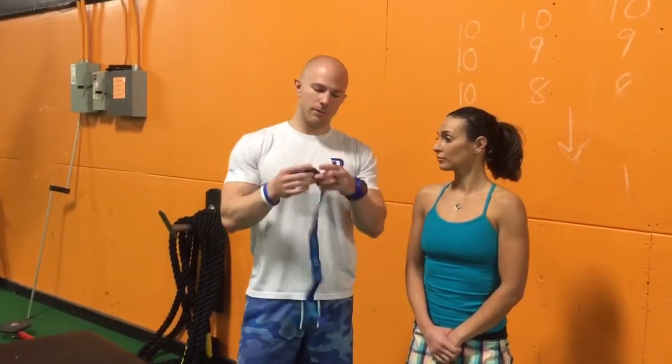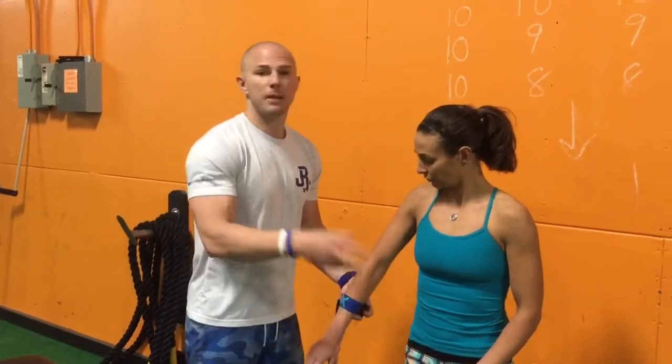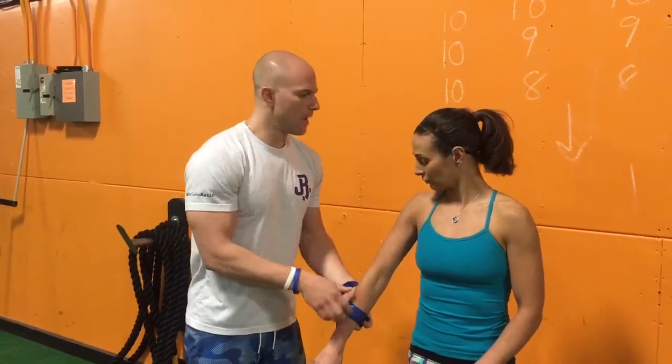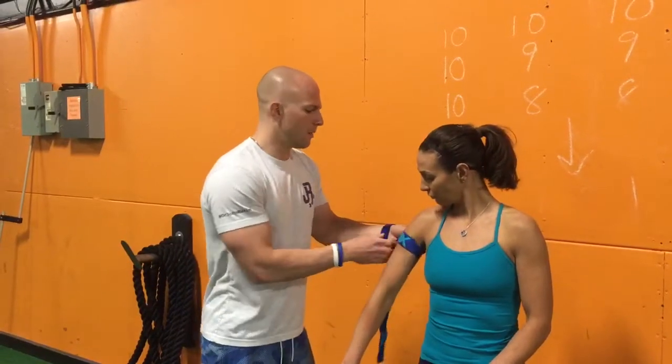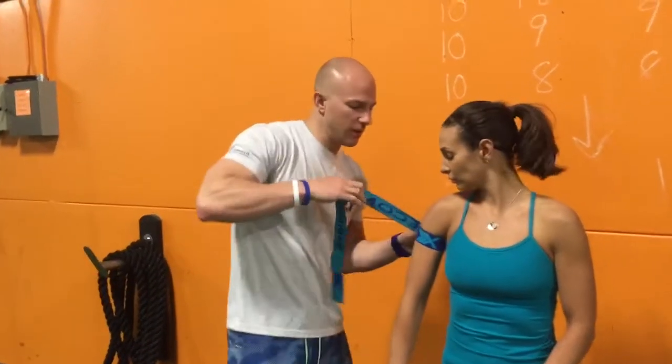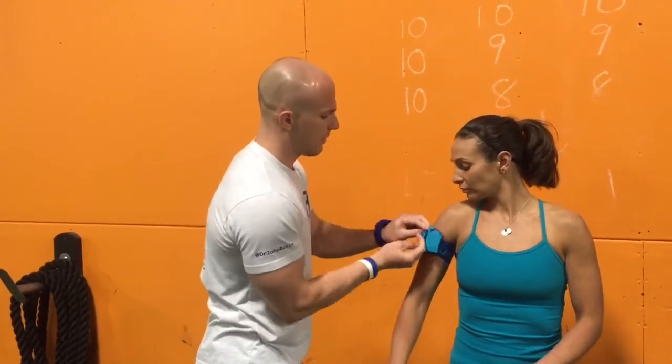This is a cuff — a simple one from Amazon, costs about 15 bucks. We're gonna strap up Lindsay here and work on the upper arms. We're gonna get it as high up into the armpit as possible. Place the cuff, tension it down to about 7 out of 10 perceived tightness, and wrap it around.